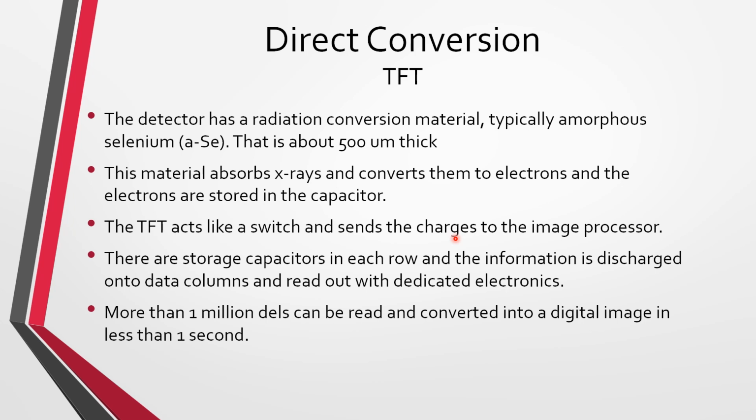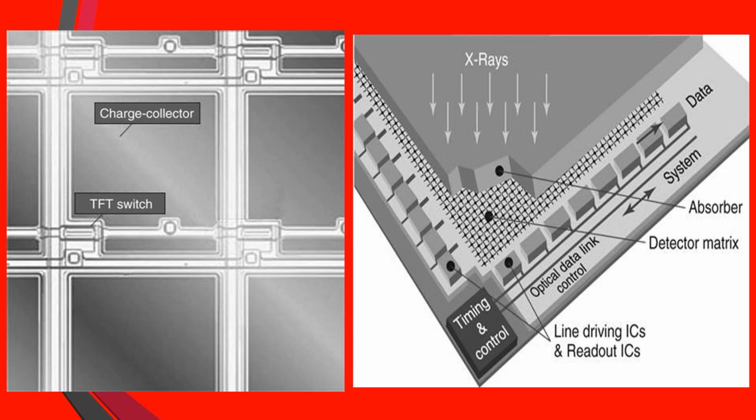So this may not be the final image, it may be the raw image, okay? And there's other image processing techniques that will happen to produce the final image, and we'll learn about those in the later videos of this series. The initial look of the image.